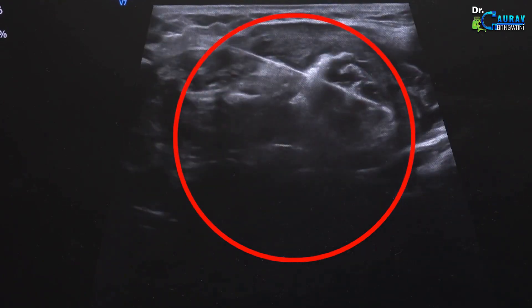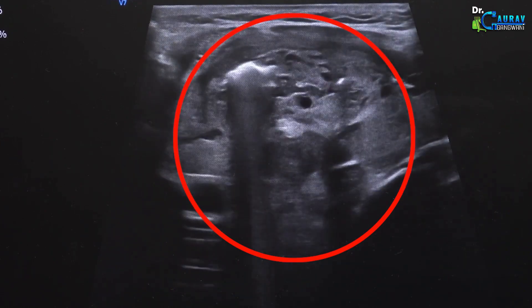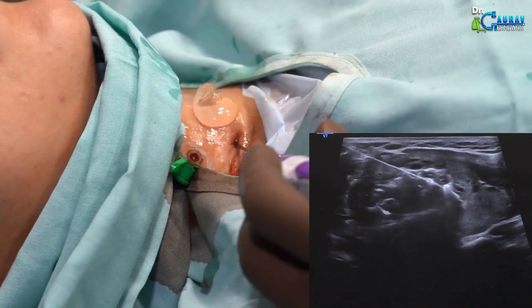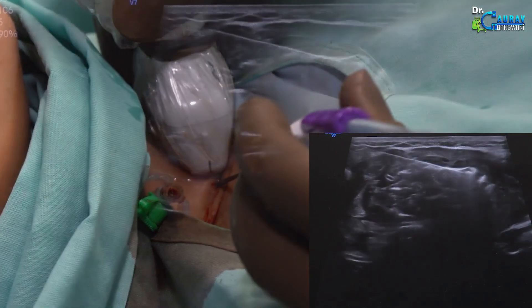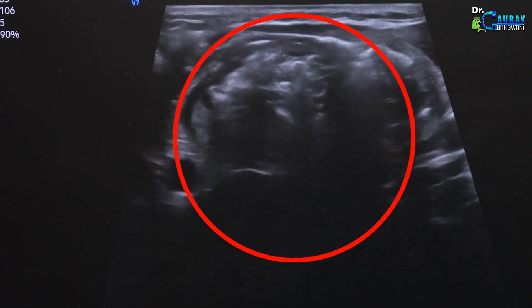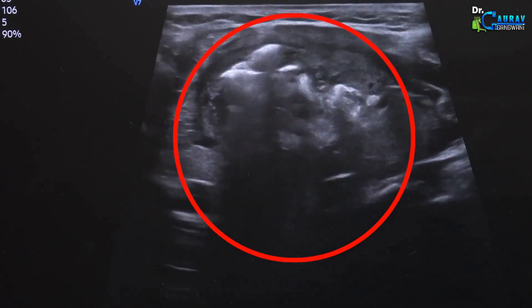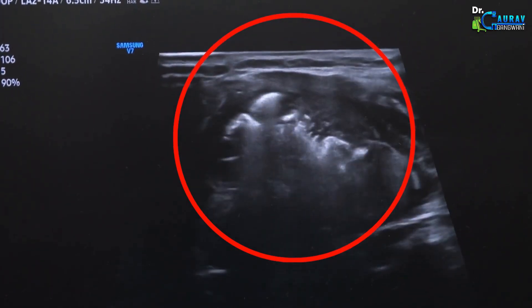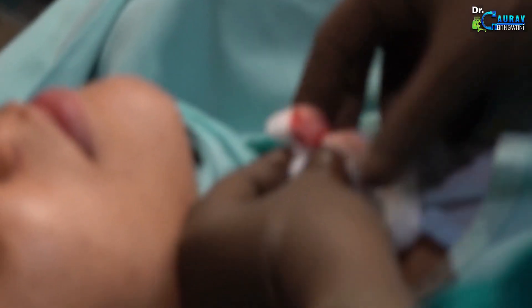You are lying under local anesthesia, talking to the patient. Let us show you a behind-the-scenes view and demonstrate what sounds the patient hears during the procedure in the OT. In our operating theatres, we usually play normal music or nothing at all so that the mind can relax. We typically play Kirtan so that patients can absorb their mind in meditation music and feel no apprehension or fear. There won't be any pain since local anesthesia has been administered. The sister will apply a little compression on the patient's neck for a few minutes and check the patient, and if fine, they can be discharged.